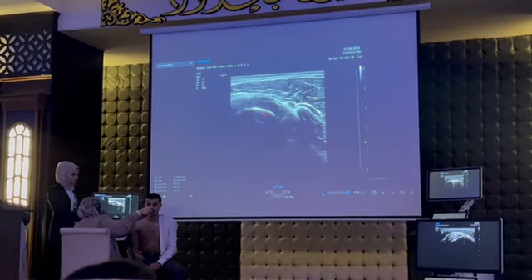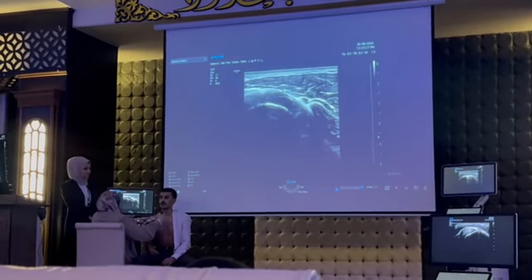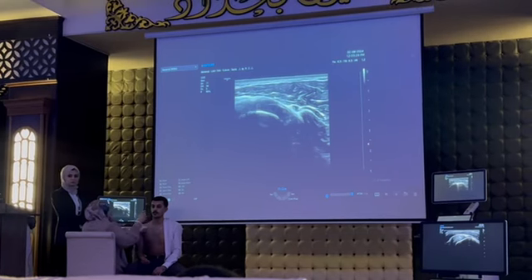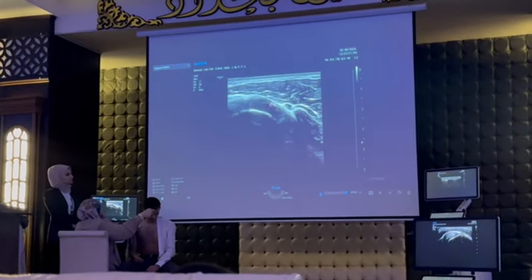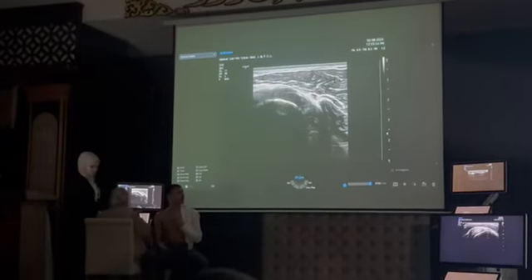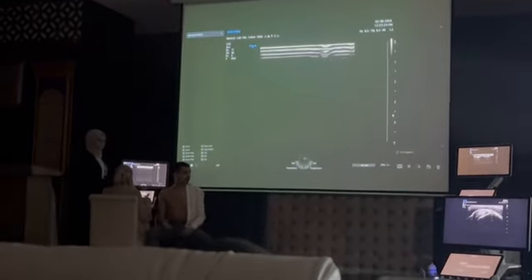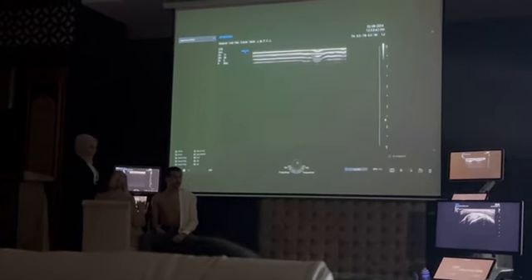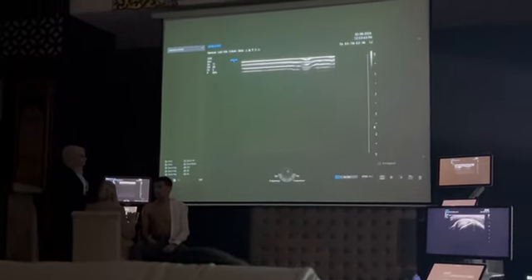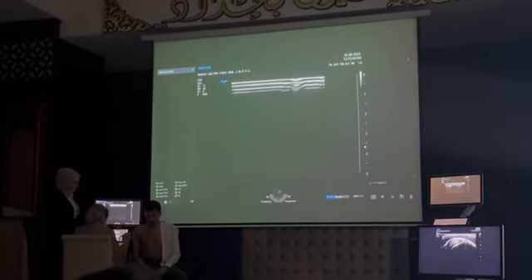I can do injection in a plane technique until the needle reaches this side, and do monovisc, PRP injection, or steroid. So this is the anterior shoulder approach. The posterior, we see when we inject just below the infraspinatus and above the hyaline cartilage of the glenoid.